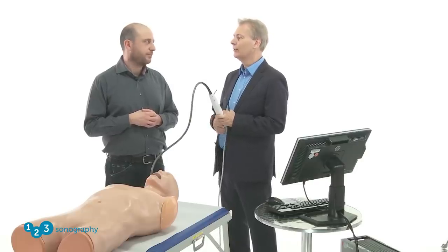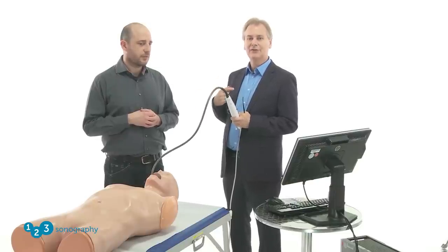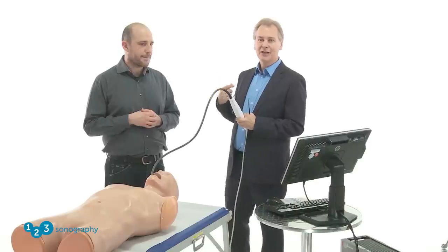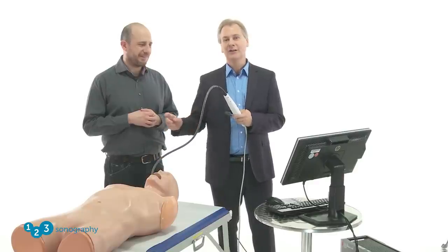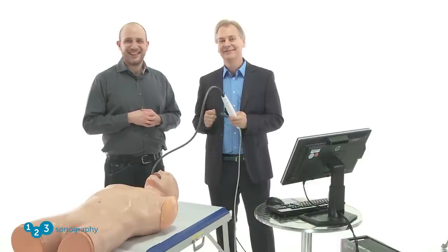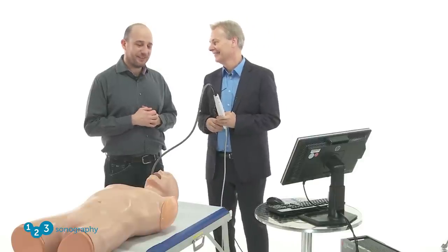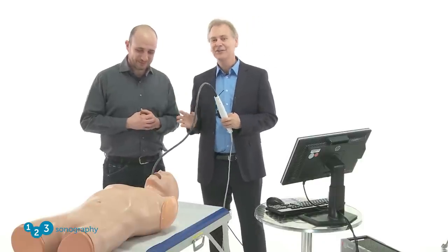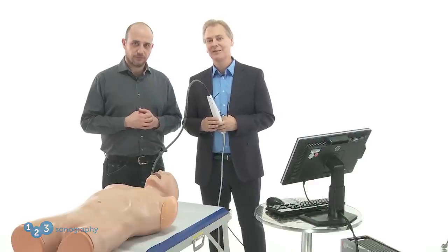Once the probe is inside, you're ready to go. One important tip: when looking at the machine and reaching for the transducer, watch out that you're not grabbing the endotracheal tube and pulling it out — you certainly don't want to accidentally extubate the patient. So this concludes the probe introduction. We will then go to the different imaging planes to show you what you see when you have the probe inside.